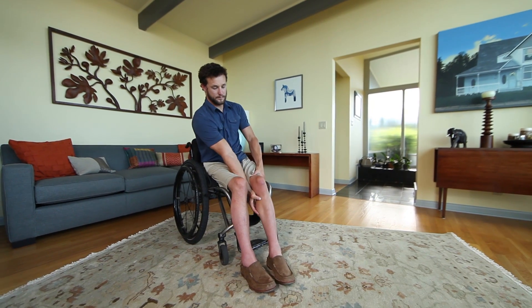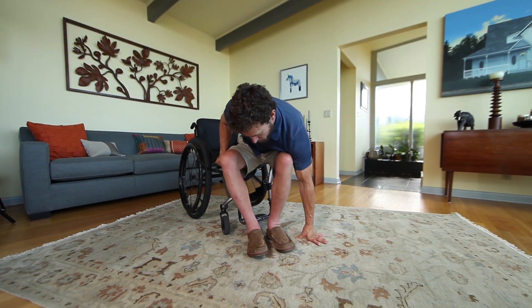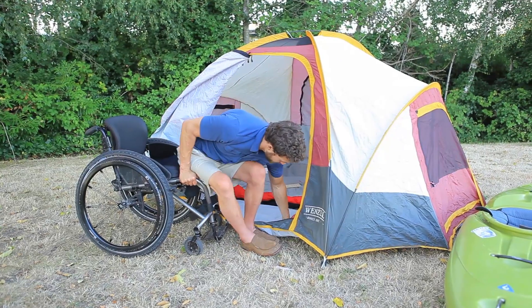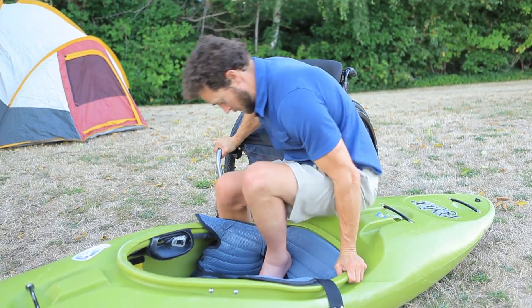This skill gives you the ability to get off the ground when you fall, instead of depending on bystanders for help. But the technique is useful in many other situations. It enables you to get down into a tent or kayak, or onto the floor to play with your child or repair the kitchen sink.